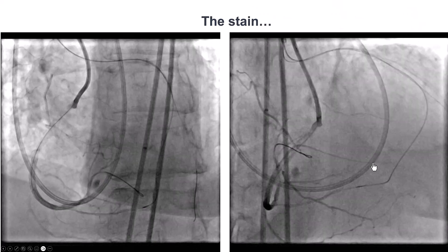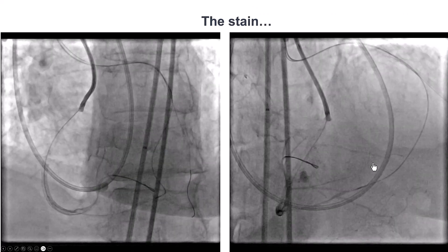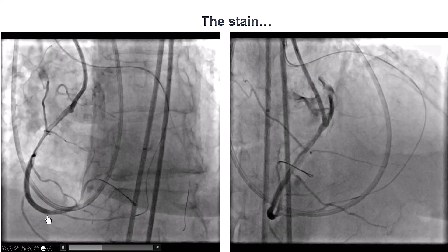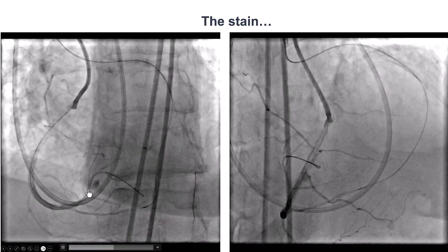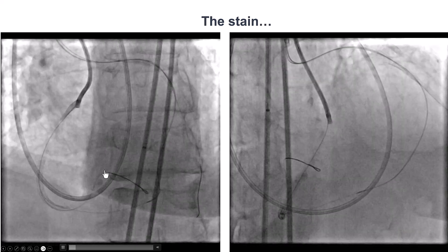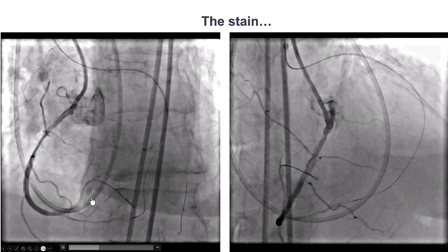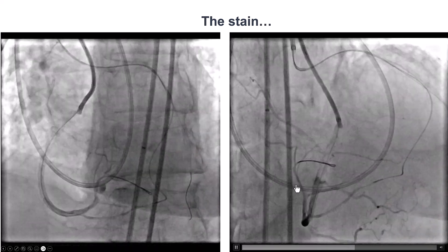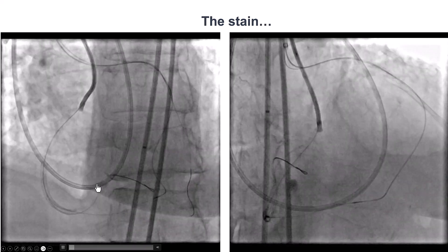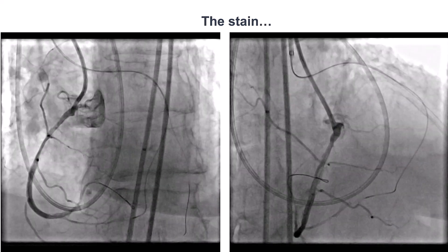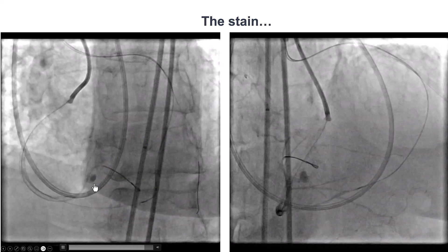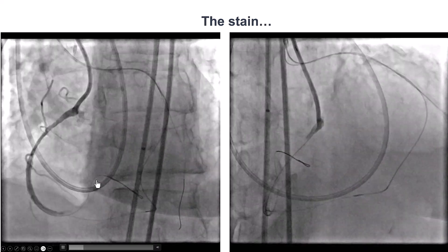After doing that, we saw good news and bad news. The good news: we now have much better flow into the posterolateral and the RCA in general. The bad news: we now have a stain. This staining likely represents a distal vessel perforation, likely from the Sion black wire when we were trying to wire into the right posterolateral.